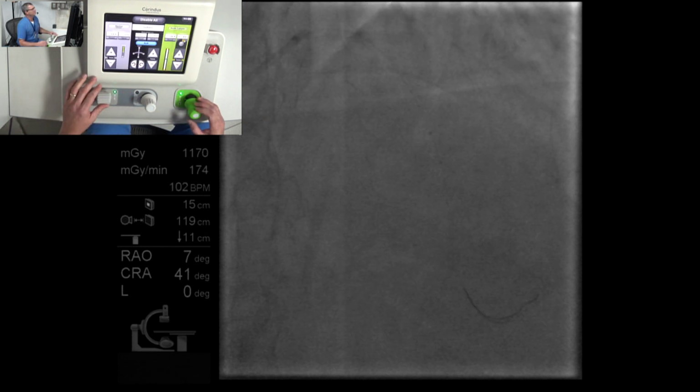Same thing. So forward on the balloon, backward on the guide to get the guide out. And then you have to reverse that sometimes when the balloon comes and reverses. Okay, so we don't have any yet. We're coming out. And as soon as they see the markers on the balloon, they yell stop.